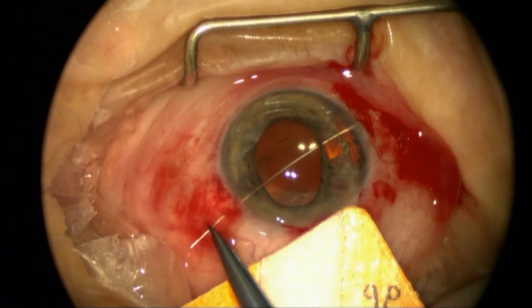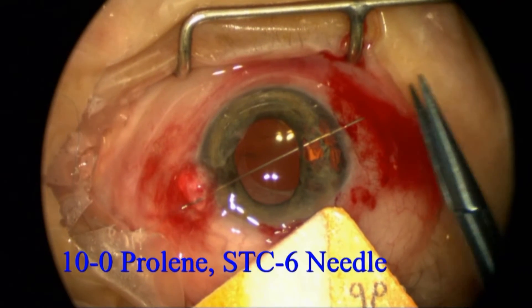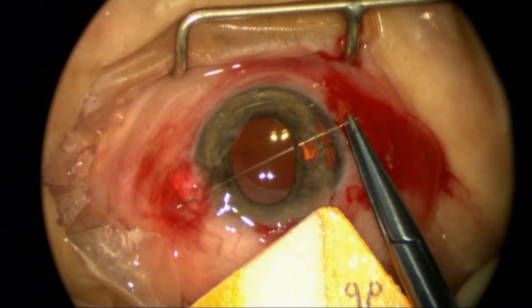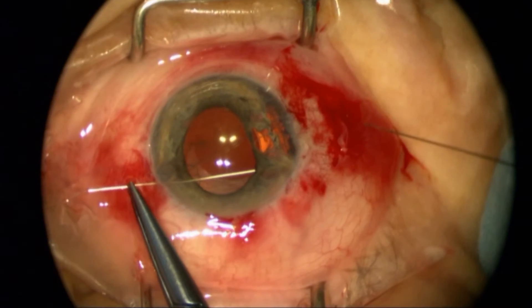Now I'm going to use an STC6 needle on a polypropylene suture to try to reduce that opening in the iris and reduce the glare that it's causing, and also re-center the pupil.